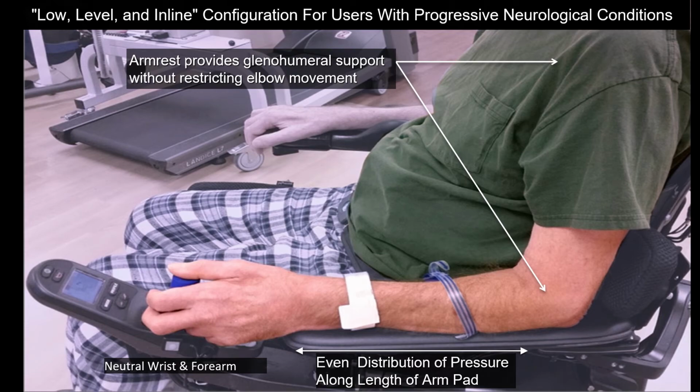And where I came up with this was that I was finding if I wasn't doing this up front, I was doing it later on when they came into the clinic. And also by setting the armrest so it was parallel, if they had ALS and their disease progressed, that armrest would start angling upward as they were reclining the back more, because they're connected.